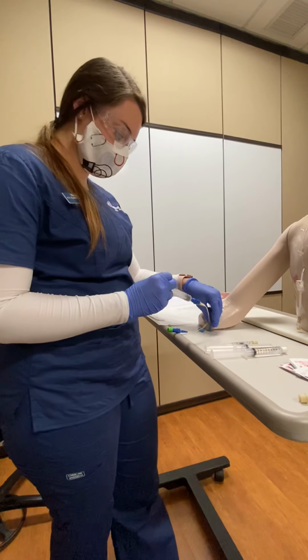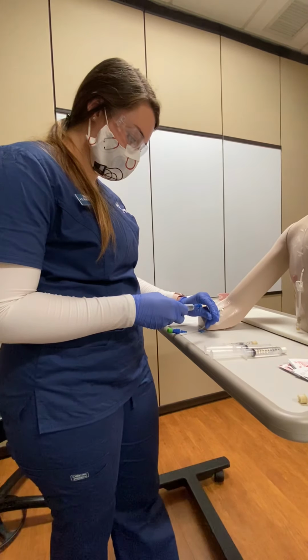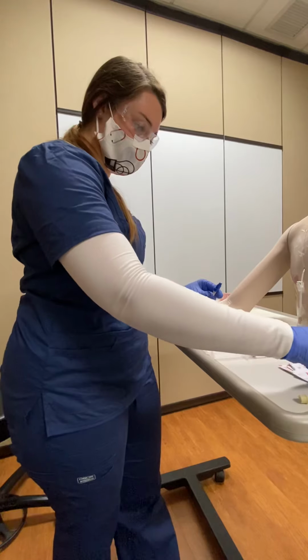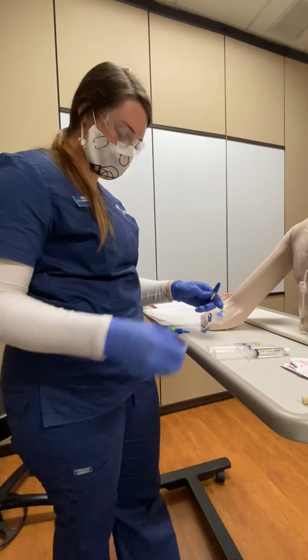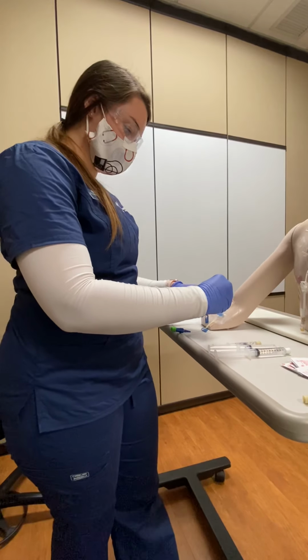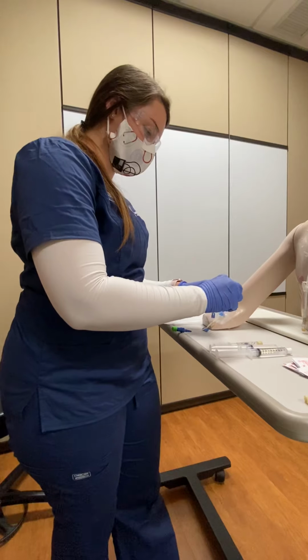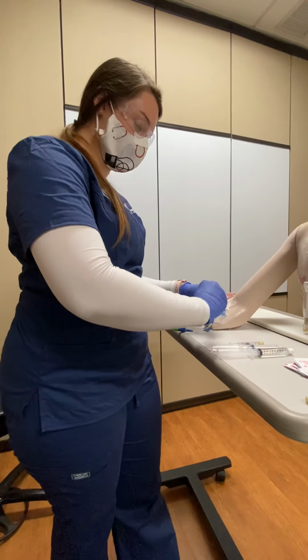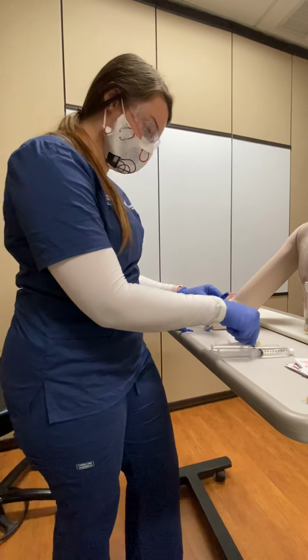Okay, I'm going to lock it. Clean. And then with this medication, I will administer over 2 to 5 minutes, and I will be observing Mary for any adverse reactions.